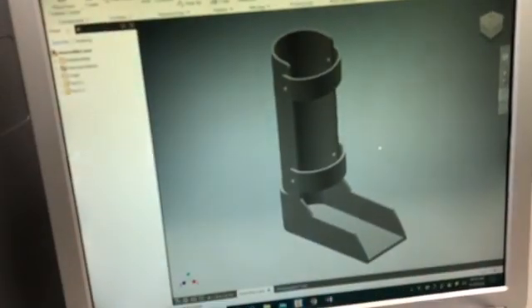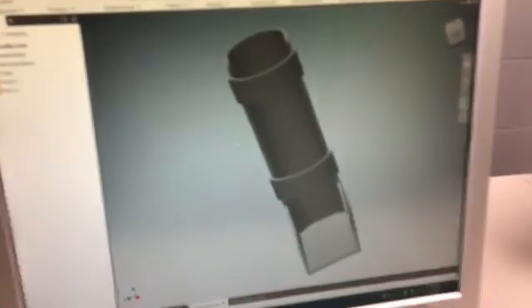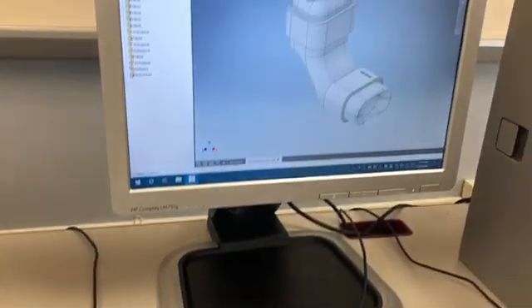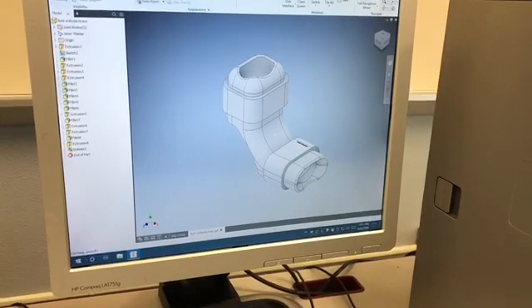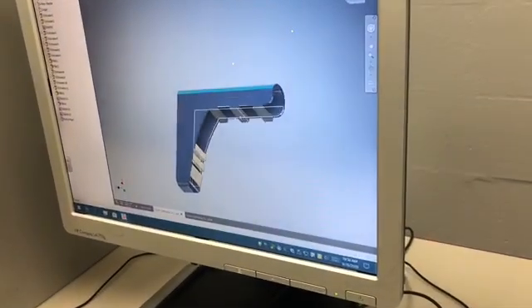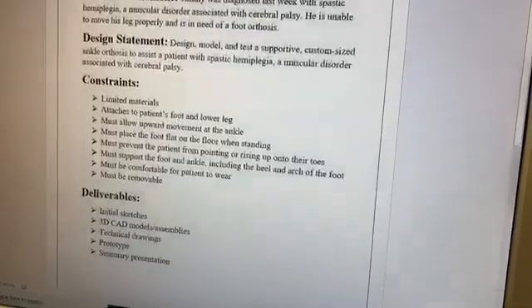This is our design for the foot orthosis challenge. It needs to attach and remove from the leg, which is what the straps are for. It also allows the foot to stand flat on the floor. It's comfortable for the patient to wear and it needs to prevent the patient from rising up onto their toes. It allows upward movement at the ankle where the foot or toes move in an upward direction towards the shin or front of the leg.